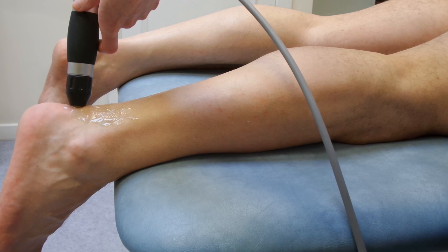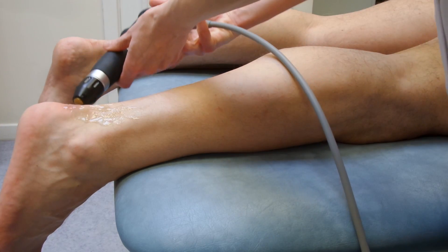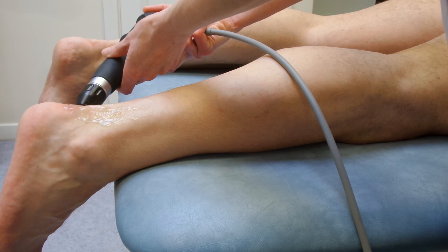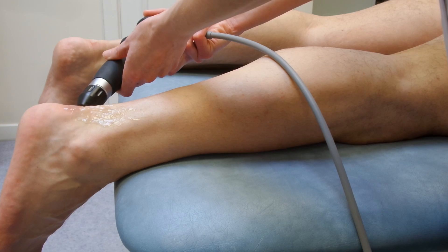Because this breaks down part of the calcaneal spur, it's very important that when you do this treatment, the patients refrain from any sort of impact loading activity — hopping, skipping, jumping, landing, and running. Because a lot of people get these spurs from running, that can be quite a blow to them. Here they're not allowed to run, and I generally don't allow them to run for four weeks after they've had the treatment.